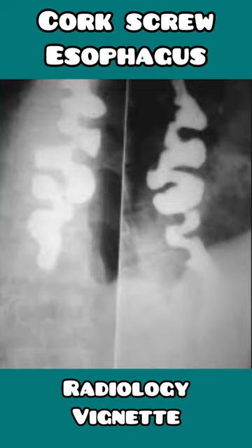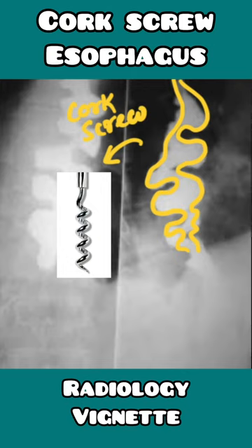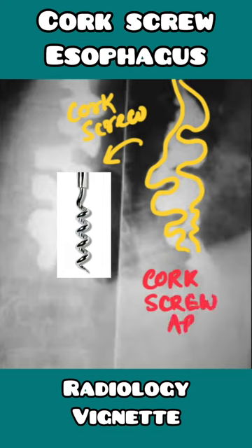In this barium swallow radiograph of the neck, we can see that the esophagus has taken up a topsy-turvy appearance. This appearance resembles something like that of a corkscrew, an instrument used to open corks of wine bottles. Hence, this is known as the corkscrew appearance and is seen in diffuse esophageal spasm.